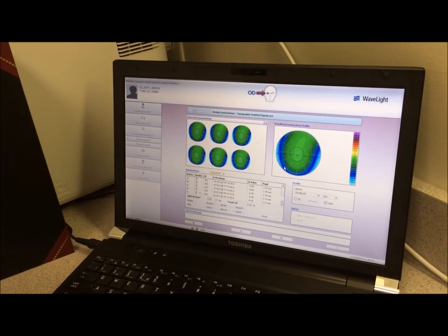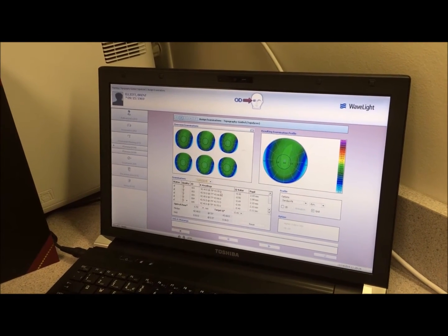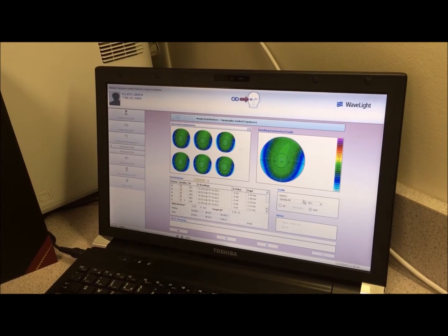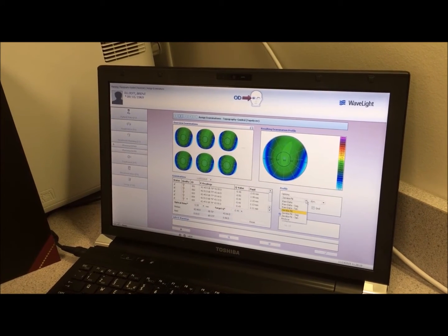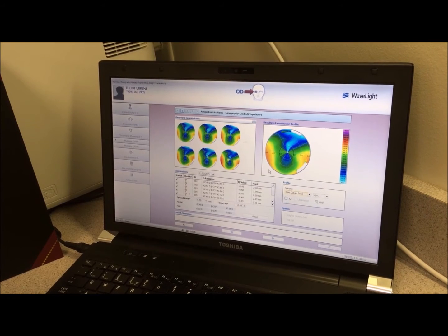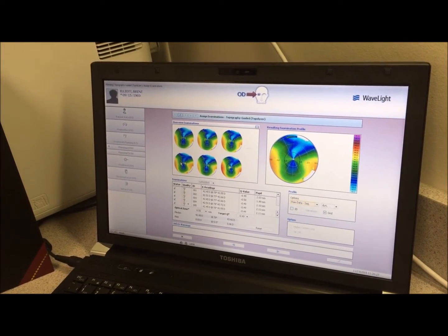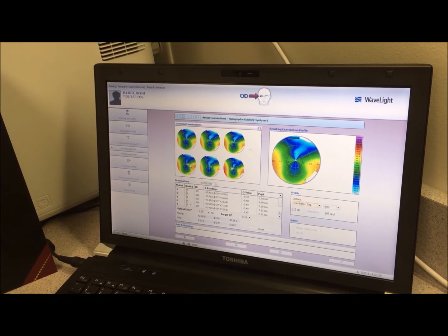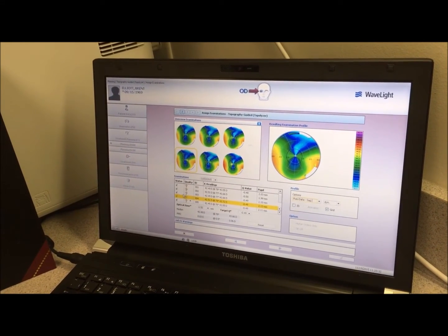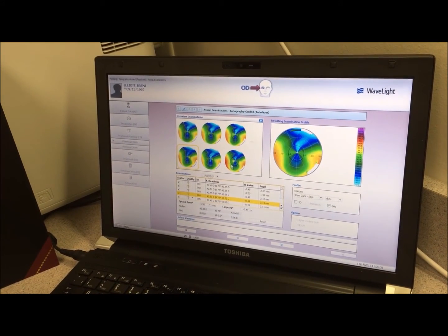We look at the various patterns, and one is looking at the raw sagittal data. You want to make sure you've got good pictures and that those pictures are consistent. When we're looking at the raw sagittal data, we're taking it down to the fine tuning and we may or may not remove various topographies based on how they fit across all of the pictures. I like to have at least four good pictures.